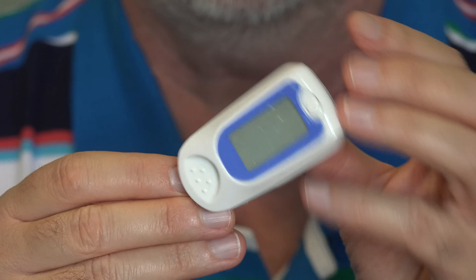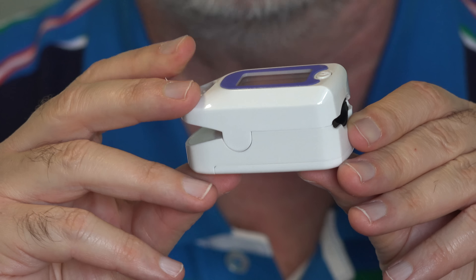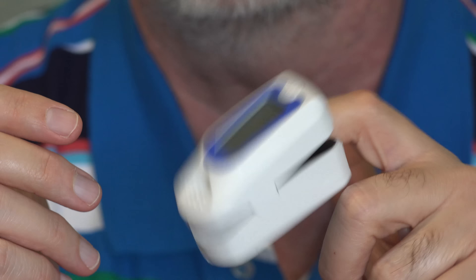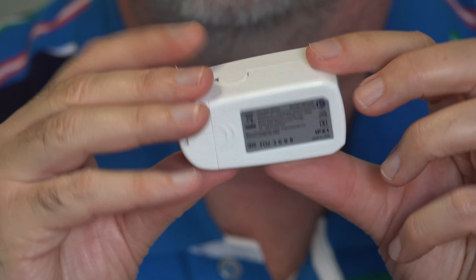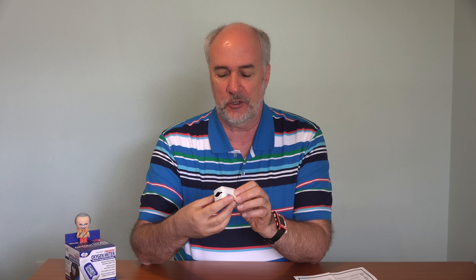Here's the oxygen meter. The screen where you'll get your numbers. You pinch it like a clothespin — that's where you fit your finger — and it holds on pretty snugly. On the bottom, you take this out to put the batteries in. Interestingly, you can get inaccurate readings if you have nail polish on or fake fingernails — that's something I didn't realize. This is accurate to within about 2%. It measures your oxygen saturation between 70% and 100%, and if it's below 70% it isn't going to give you a reading.